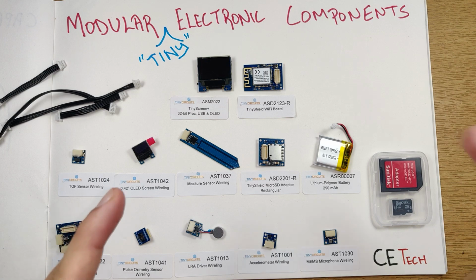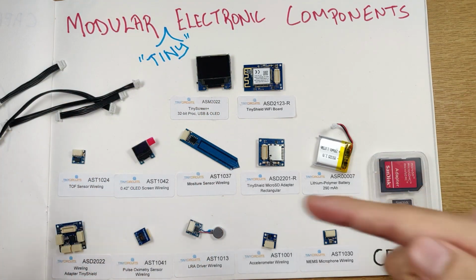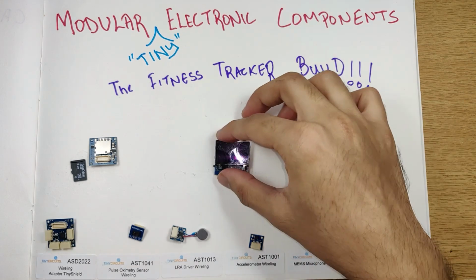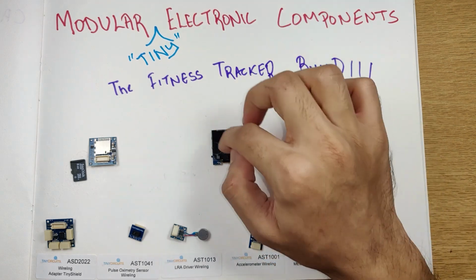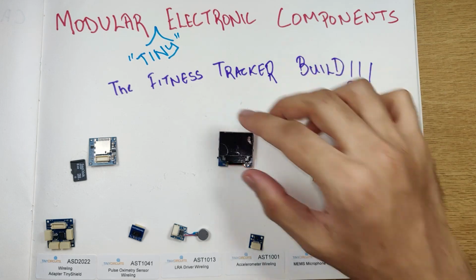So let's move on to the interesting part and start building the fitness tracker that we plan to with these components today. So now we have all the parts that we need to build our fitness tracker. But before that, we'll have to set up the tiny screen plus that we have over here. We'll have to configure our laptop, install the drivers for this, and install the library.